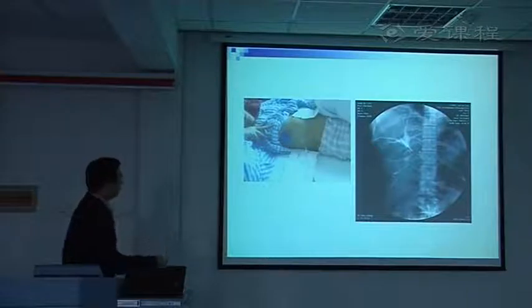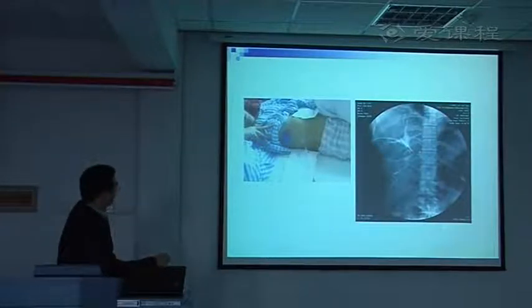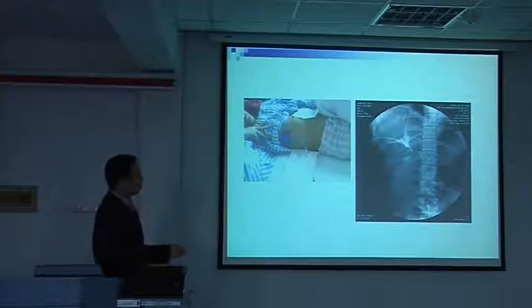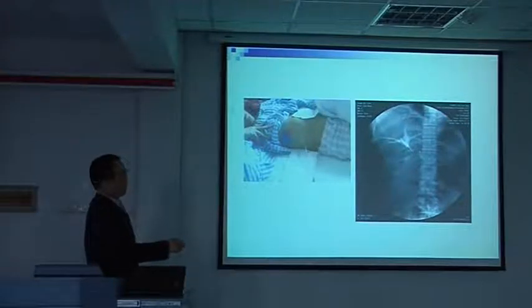This patient has a PTCD catheter, and from the catheter we injected contrast. We showed all the intrahepatic ducts and also the right hepatic duct. This patient has had a left hepatectomy performed, so we only showed the right intrahepatic duct.